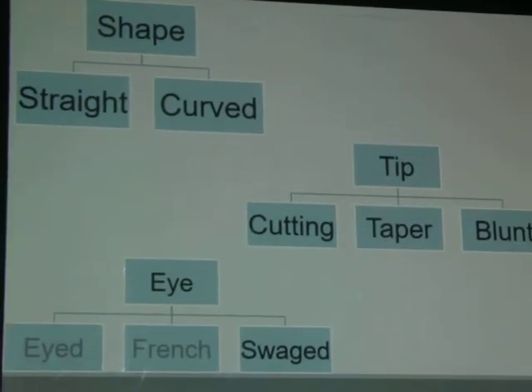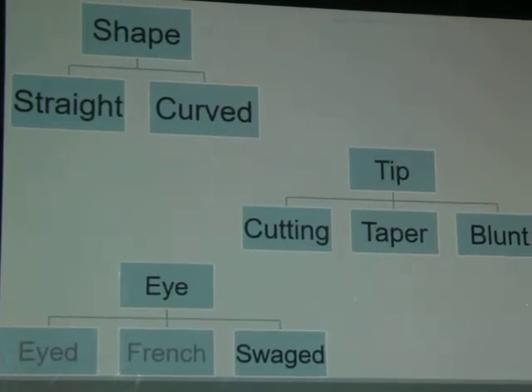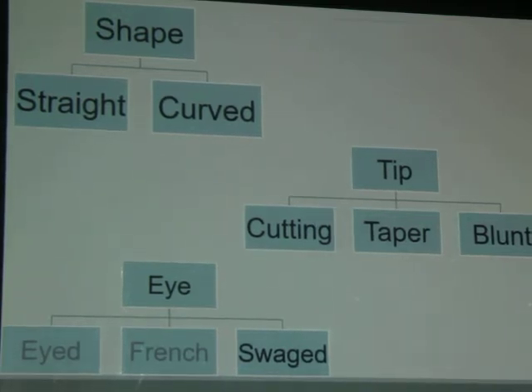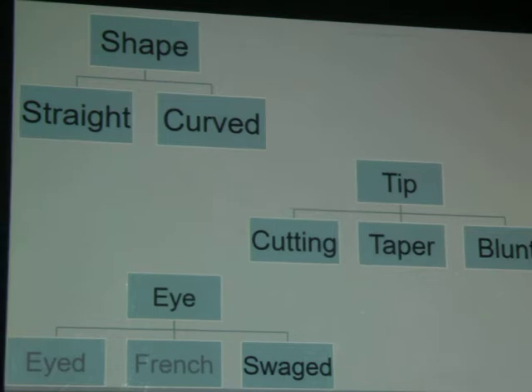زمان كان السوتشر بتيجي لوحدها والنيدل بتيجي لوحدها، ولازم الممرضة بقى تلضم الإبرة في الخيط. طبعا دي محتاجة حد بيشوف كويس. And there is another negative point that now you have a needle and 2 strands of suture material.